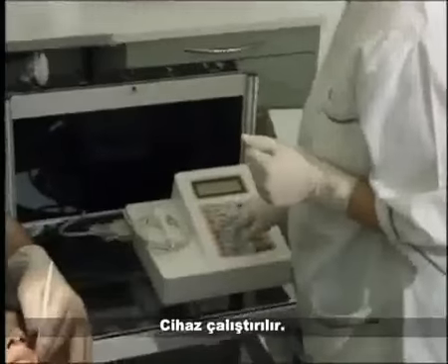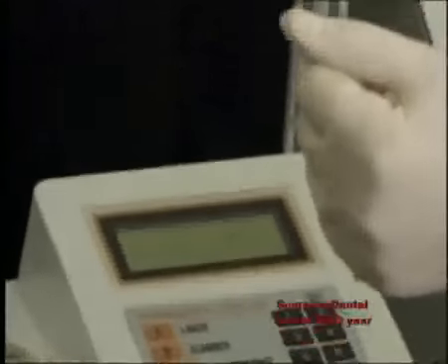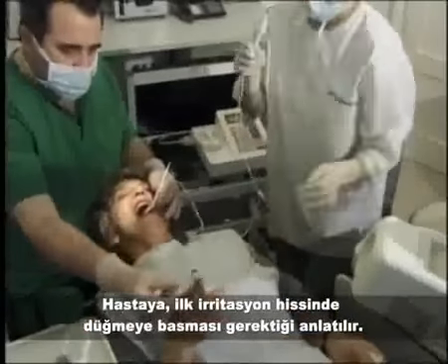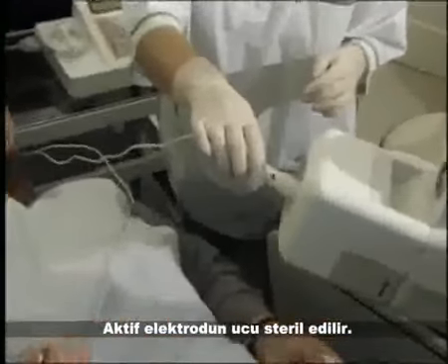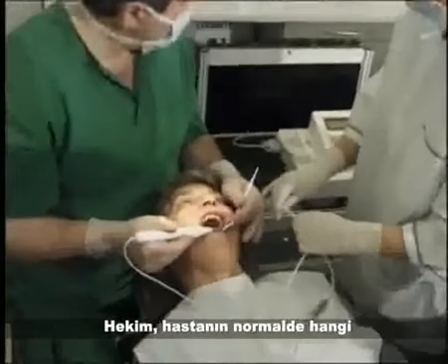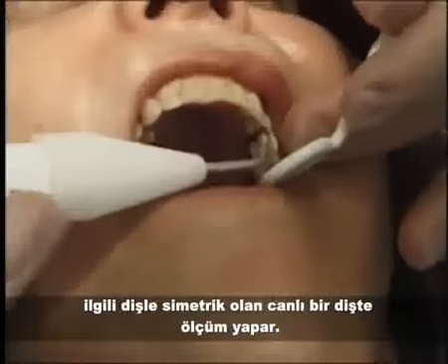The device is then turned on. The passive electrode is placed in the patient's right hand. She is instructed to press the button at the first sense of irritation. The tip of the active electrode is sterilized. The dentist measures a symmetrical vital tooth to register the current intensity at which the patient reacts normally.